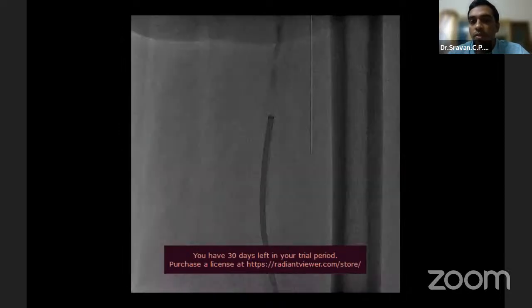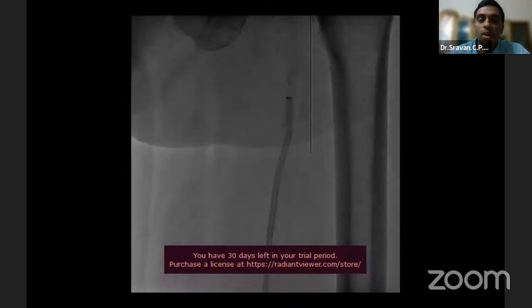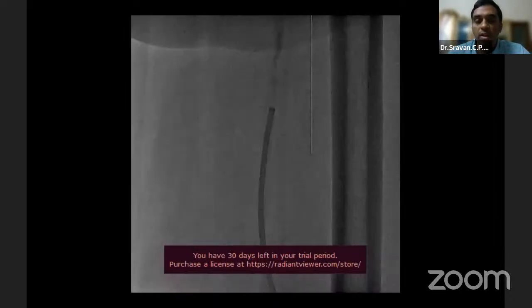So this time, when trying to suck out the common femoral vein region, we couldn't use a separator, so I had to go bareback, just with the CAT8 and manually torquing it, trying to remove the thrombus load there.